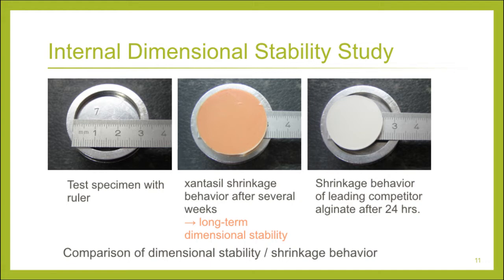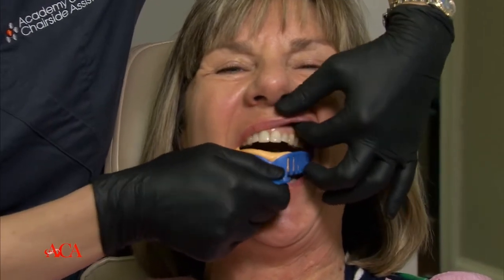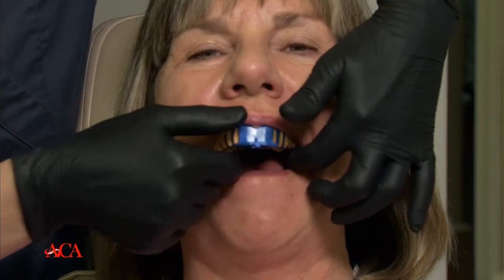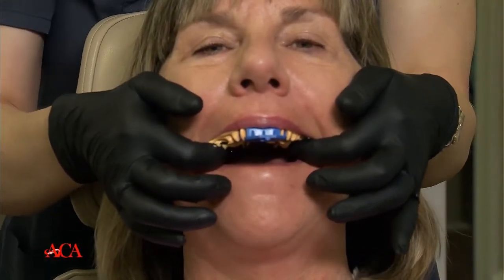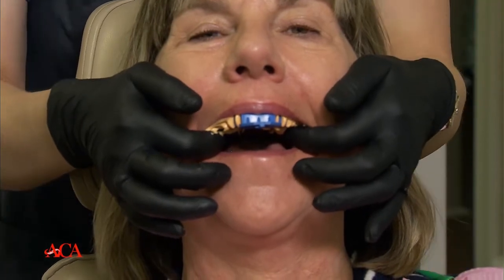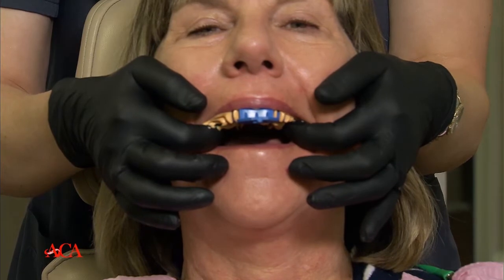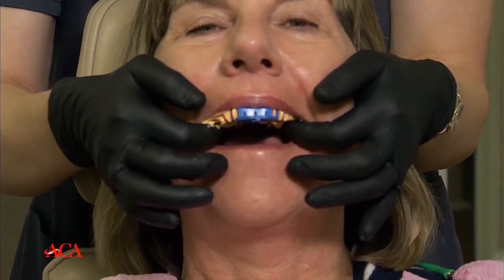So let's go to our video real quick and let's show you how we take these. I'm going to take my impression, and I want you to really relax your lips, and I'm just going to push that up, and I want you to bring your lips over that tray for me, and I'm going to come right around, and notice where I'm holding that tray. I'm right in the premolar area. I'm also able to look down and make sure that the tray handle is in line with her midline. This material is basically a 1 minute working time and a 1 minute 30-second fully set.